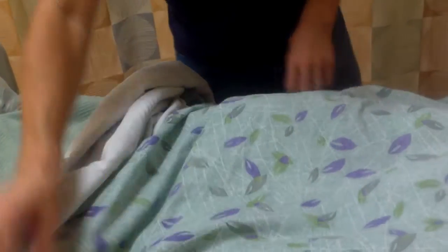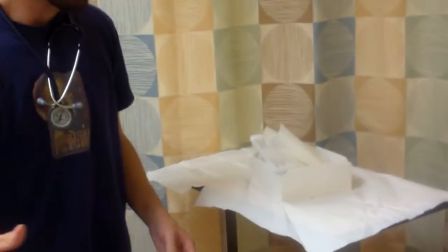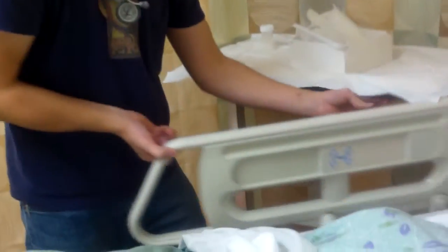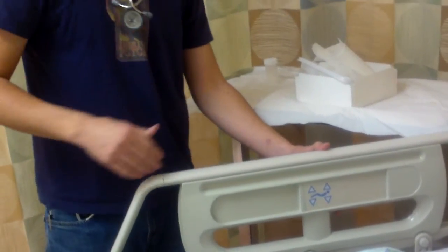I would document everything, the time, catheter, and make sure that she was comfortable. And if there's anything else that I can get her at this time, I would make sure the call light is well within reach so she can call me at any time. Make sure the side rails are back up. And I would clean up all of my equipment.